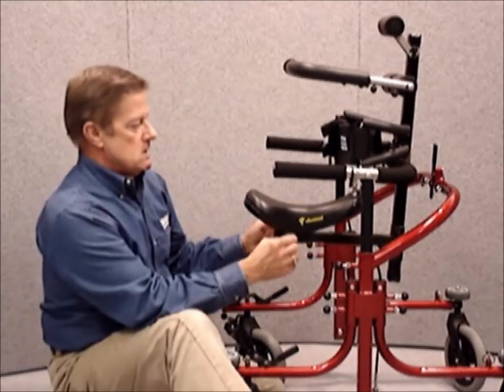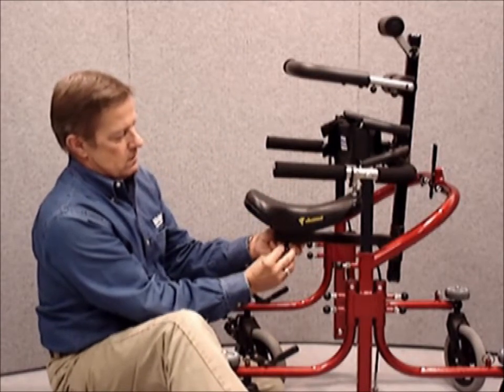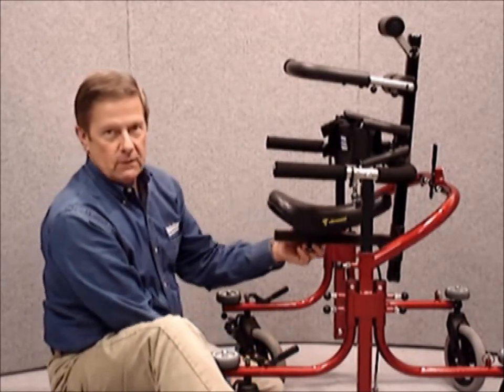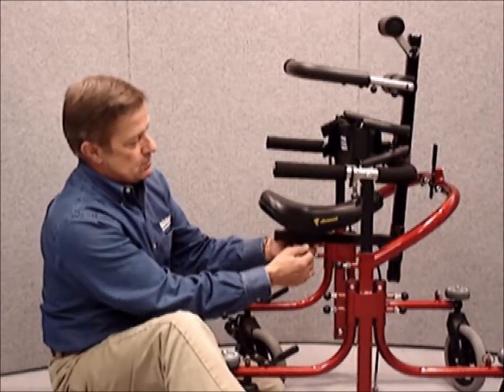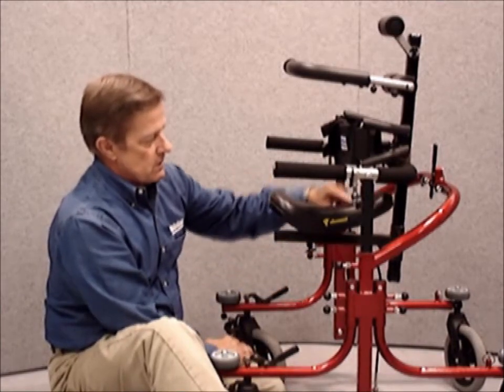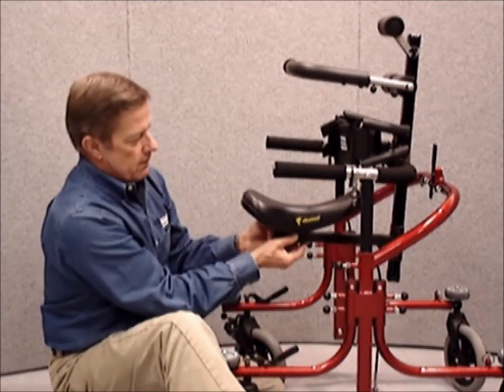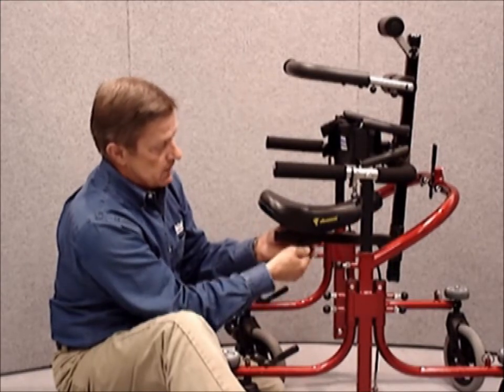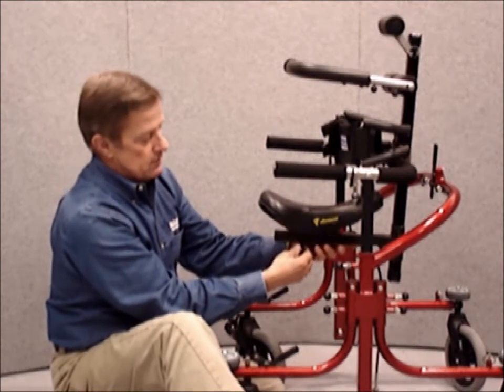To adjust the seat forward or back, we loosen the T-nut release knob on the back side underneath the seat, and that will allow us to shift the unicycle seat forward or back. When we have our desired position, we can tighten it down. This is going to be primarily for user comfort, at their discretion or your discretion as to where you locate it, forward or to the rear. Again, tighten it down. The angle of the unicycle seat can also be changed.